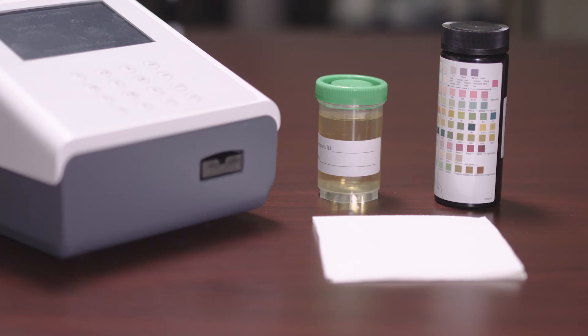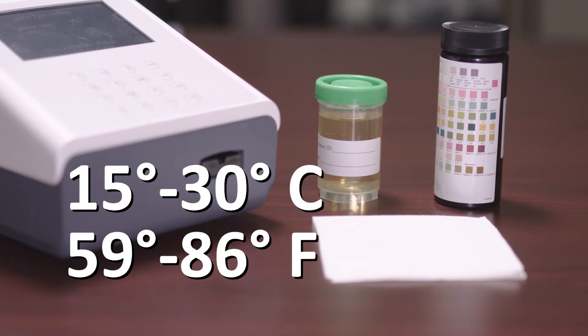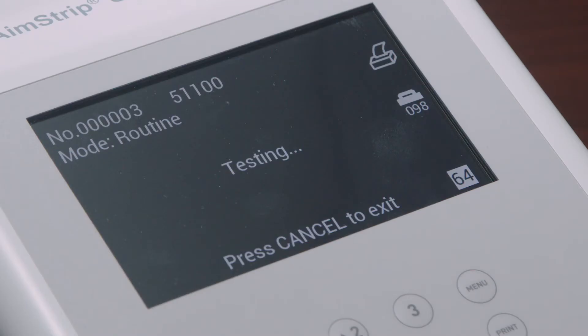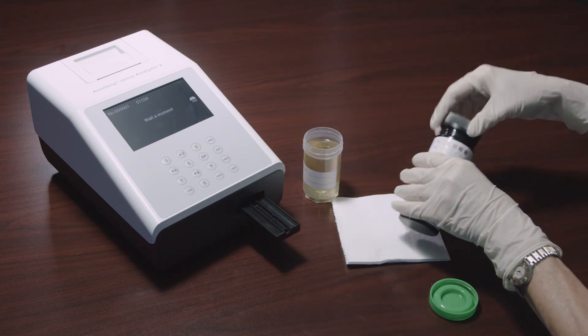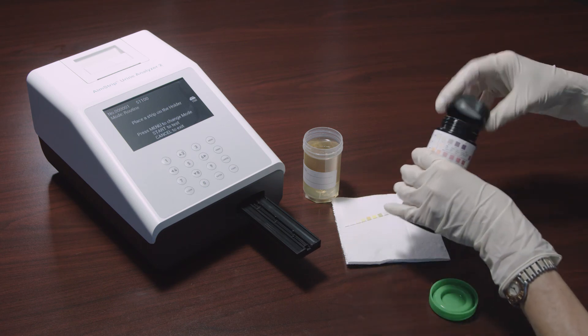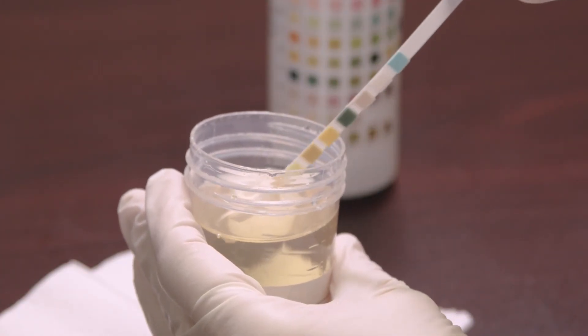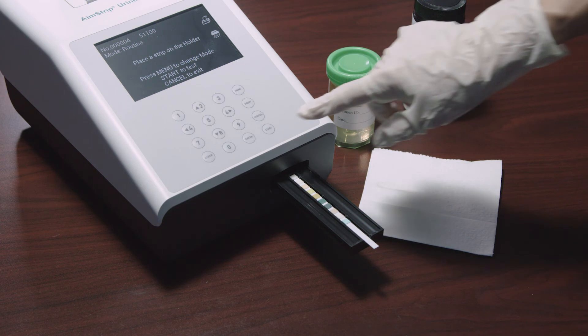To begin testing, allow the strip, urine specimen, and controls to reach room temperature — 15 to 30°C or 59 to 86°F — prior to testing. Remove the strips from the closed canister. Once Start is pressed, the clock counts down from 65; the operator has three seconds before the triple beep sounds to immerse the strip into the urine. Immerse the reagent areas of the strip into the sample for one to two seconds after hearing the beep, then run the edge of the strip along the container edge to remove excess urine. Touch the edge of the strip to absorbent paper to avoid mixing chemicals and soiling hands, then place the strip with the reagent area facing upwards onto the strip holder.